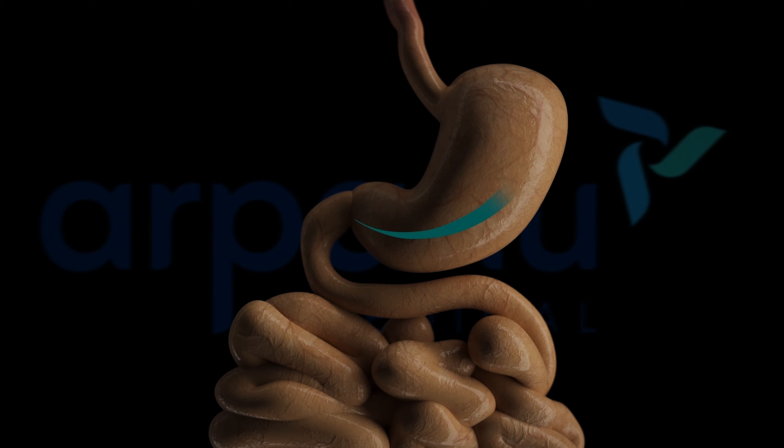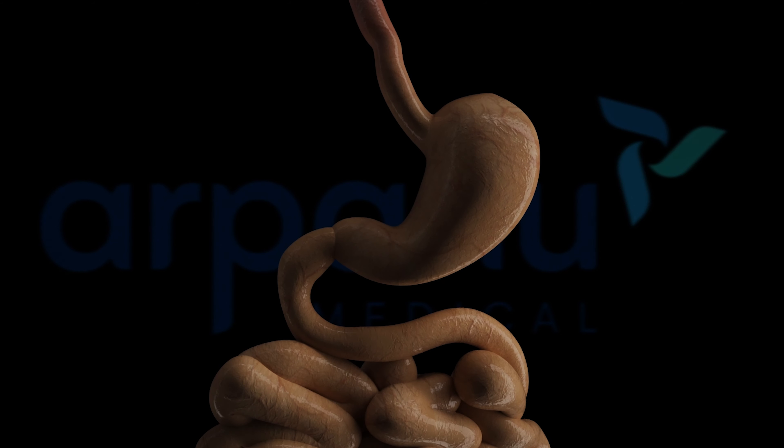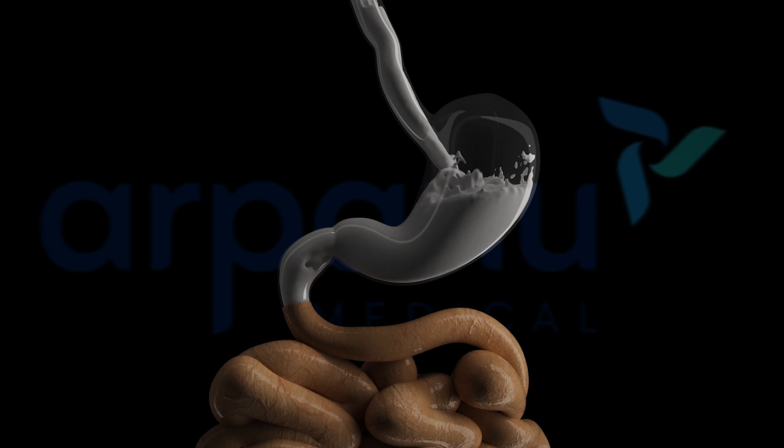In the gastric sleeve operation, the surgeon removes up to 80% of the stomach using a stapling device, creating a small pouch in the shape of a banana. The newly formed stomach can hold 50–150 milliliters.